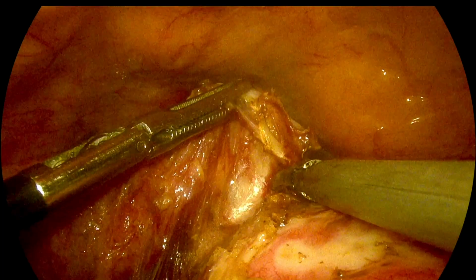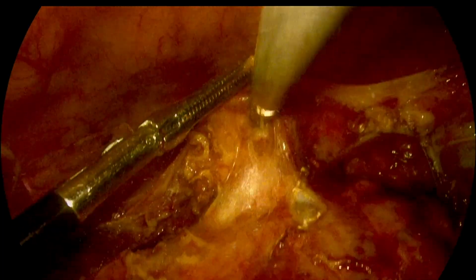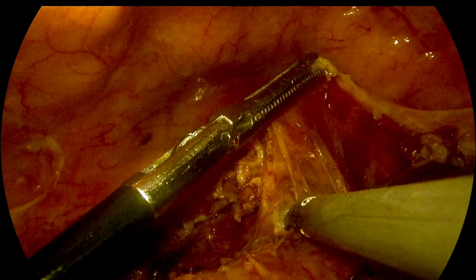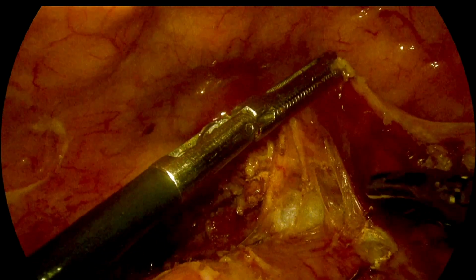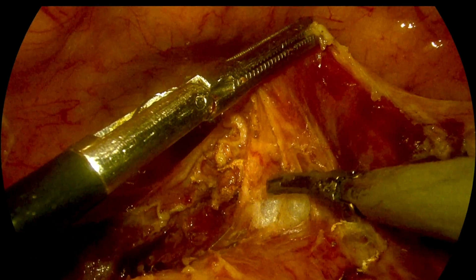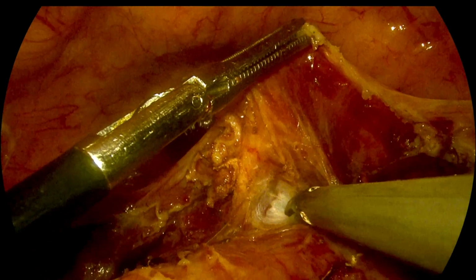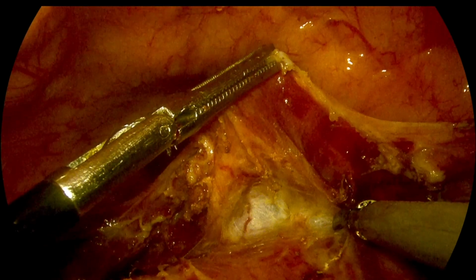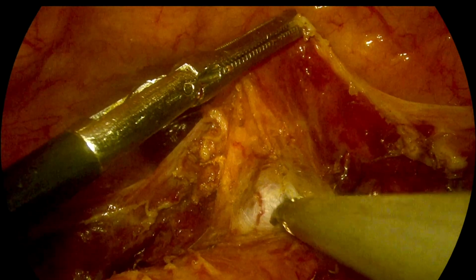And every time we have to confirm we are not dividing the bladder at this junction. So every time we are doing a blunt plus sharp dissection, a small amount of blunt dissection and then sharp dissection, but keeping the avascular plane in our mind.